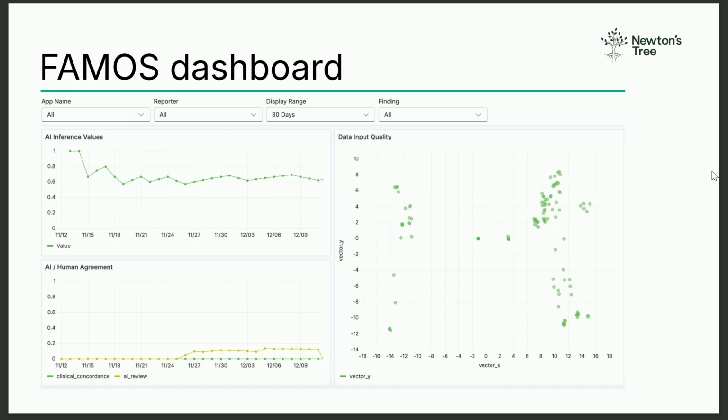And then we said, well, what could lead to that? What could lead to overdiagnosis? So one of them I mentioned is automation bias, right? If the AI predicts something wrong and the radiologist is not paying attention, then that automation bias has now led to that harm. The other one is a shift in AI prediction behavior. If there is an update to the AI algorithm and now it's sort of overcalling pneumonia in the middle of summer, you're like, there's probably something gone wrong here. And so we should measure how often it's predicting different things and to see if that matches with the natural prevalence of those things. And the final thing on the left-hand side is data quality.